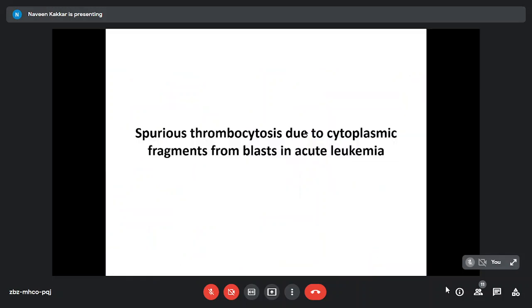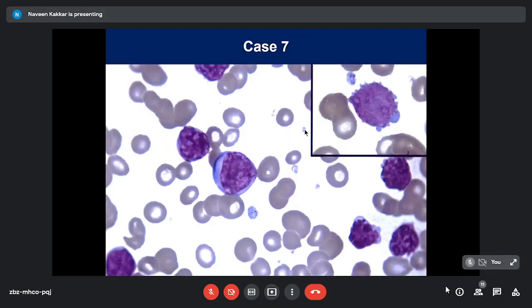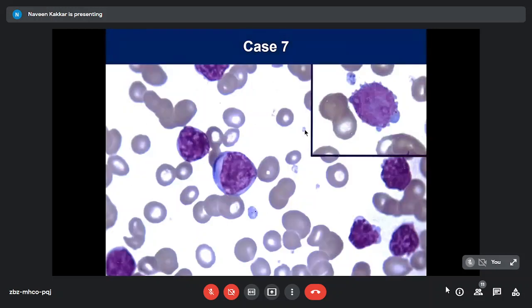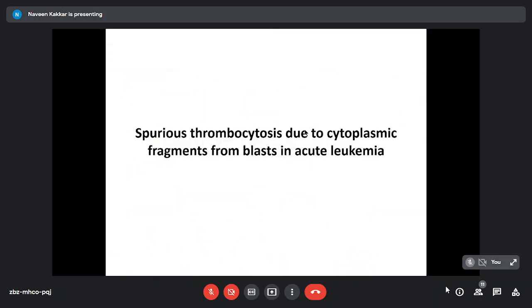So this is spurious thrombocytosis due to cytoplasmic fragments from blasts in acute leukemia. Actually not thrombocytosis because the count was barely normal, borderline normal. So this is a spurious rise in platelets because of cytoplasmic fragments in acute leukemia. This can happen in leukemias, myeloid also, monocytic also, and even lymphomas. So fragile cells can shed off the cytoplasm, which can be counted as platelets falsely.